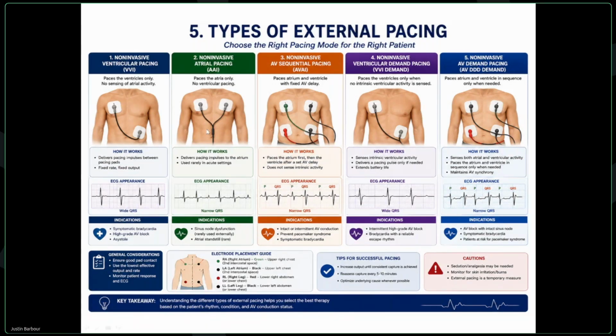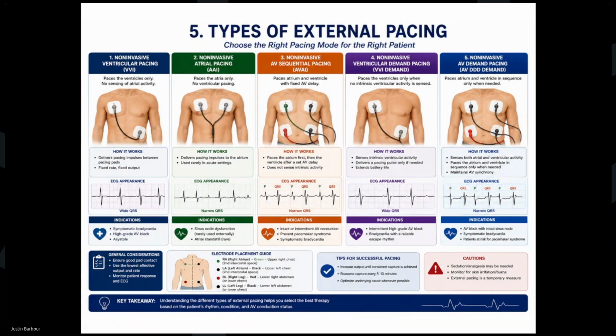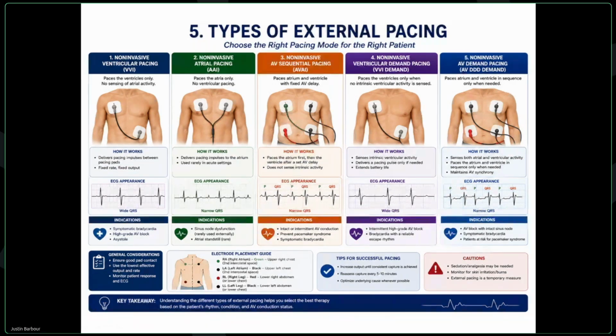And you'll see, we've got lights, little flashy LEDs on the pacemaker. That'll give you an indicator of what's going on inside the device. But you should be aware there are 4 different leads that come from the pacemaker. Sometimes you can also have ECG that come into it, so that helps it determine what's going on with the body. But there are different modes, and you'll see it abbreviated.